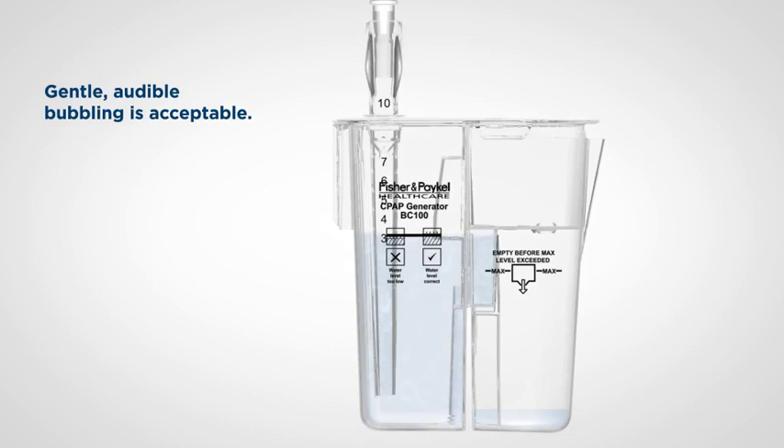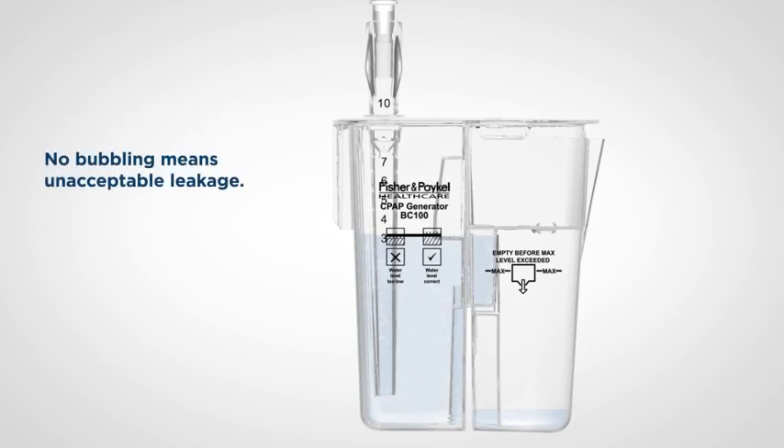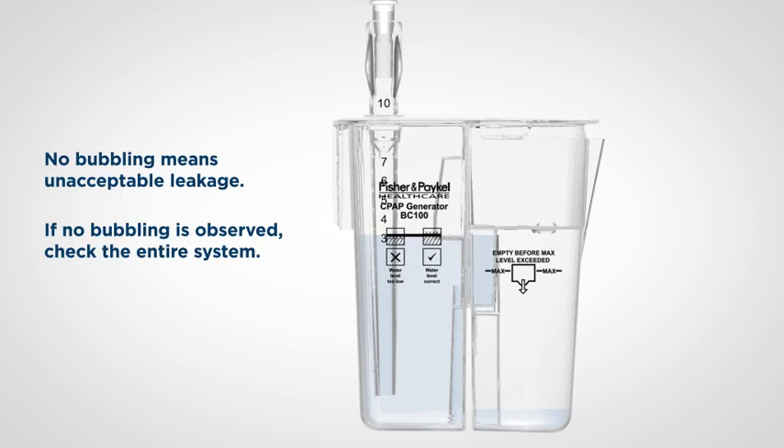Observe the CPAP generator. Gentle, audible bubbling is acceptable. No bubbling means unacceptable leakage. If no bubbling is observed, check the entire system. Remove the correct port cap from the pressure manifold before connecting any monitoring device.